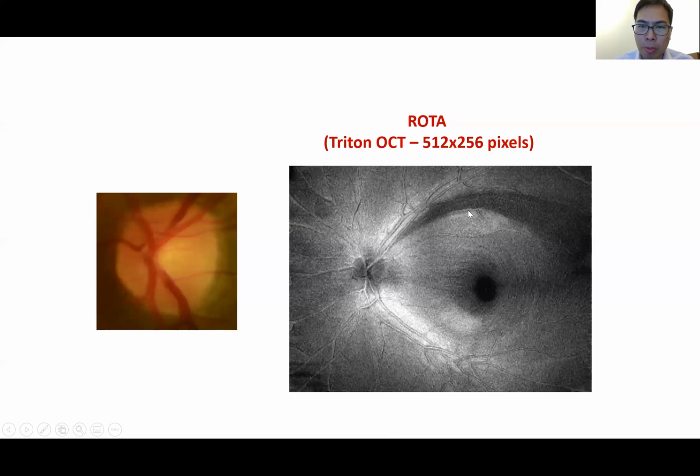It's only when we go beyond the optic disc region that we can appreciate the abnormality much better, because of the wedge-shaped feature. We see wider loss of the RNFL when it gets closer to the macula. When you only focus on the rim, you're going to miss the abnormality because the damage here is relatively focal. So the key lesson here is you need to go beyond the rim. You need to go beyond the circle assessment of the retinal nerve fiber layer.